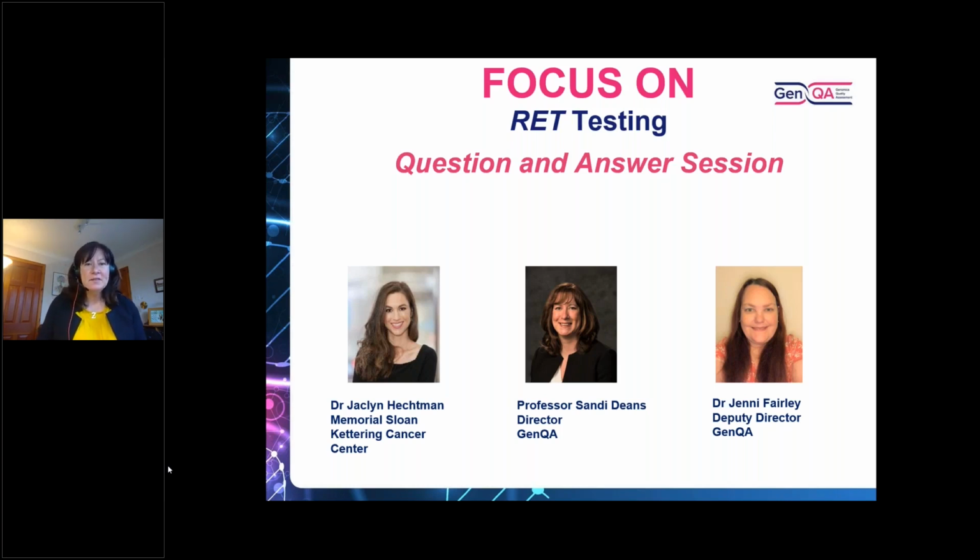Great. Paulina has come back again saying she also meant for EQA purposes. So Jenny, where are we about supplying more material for NGS testing labs for this EQA? When we send out slides for labs who test both DNA and RNA, we will provide them with some more sections now, because we appreciate if you're getting DNA and RNA, you do need a bit more. However, all our sections have been validated by laboratories using appropriate methods with the amount of material we send out.